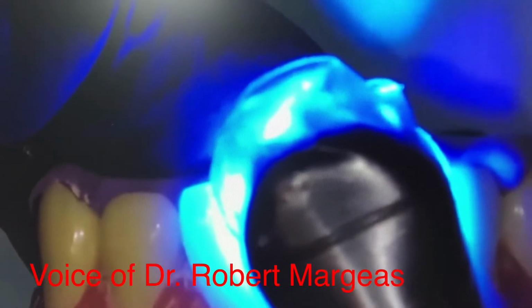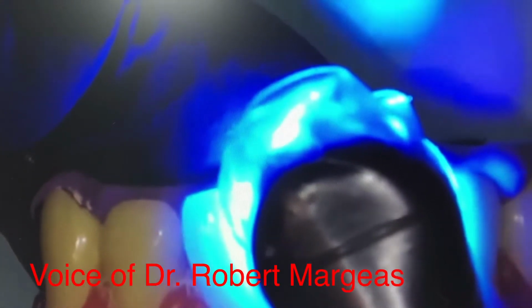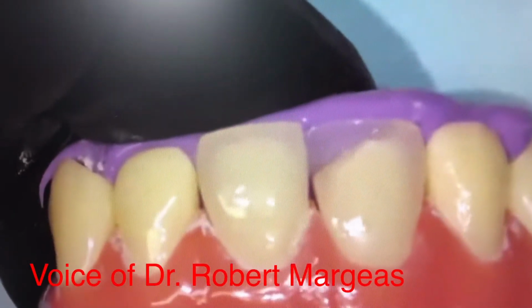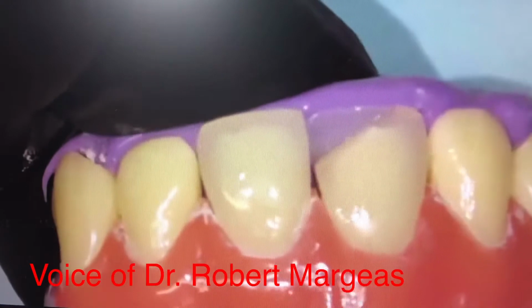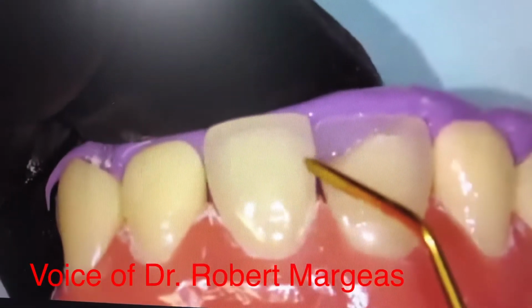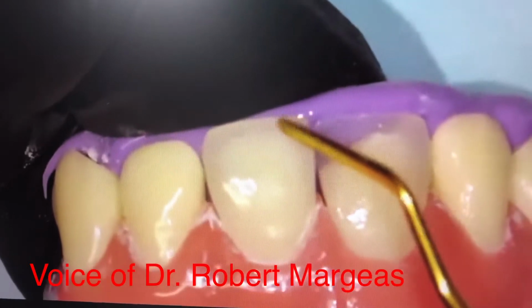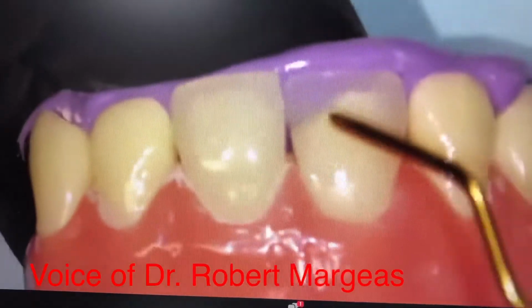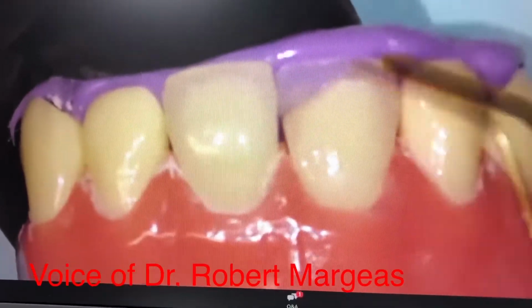This is not for strength. This is to create that translucency. If I don't have this translucent material on the lingual, I'm not going to be able to copy the adjacent tooth. And what I want you to see on the adjacent tooth is this. Do you notice that when I look at the tooth here, you can see all this translucency here in the interproximal, and then at the edge where we have 3 dinky little dental lobes, and then it comes up translucent. This is what this is going to be able to create, that translucent.